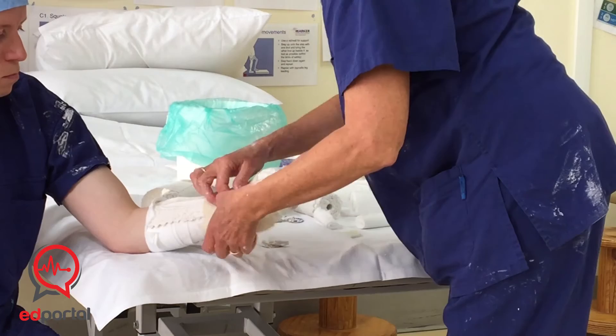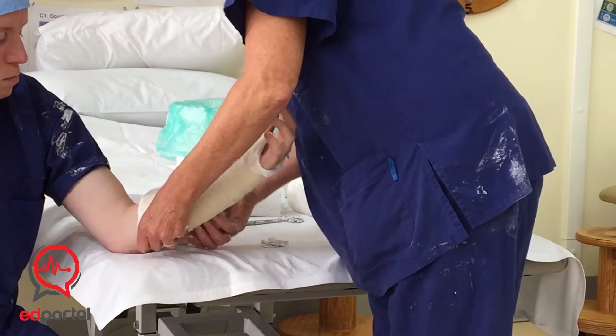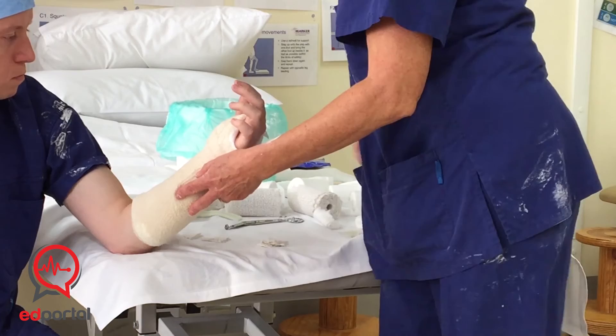And it's just the same wrap again — right around the wrist, and just roll it down. You presume this person has got some swelling there, that's why you put the slab on. What will happen then is this cast will start to loosen up when the swelling goes down, and they'll come into outpatients and we'll apply a more permanent cast.